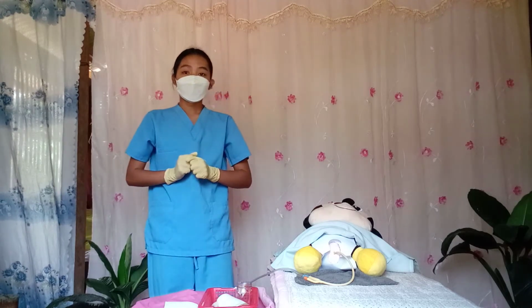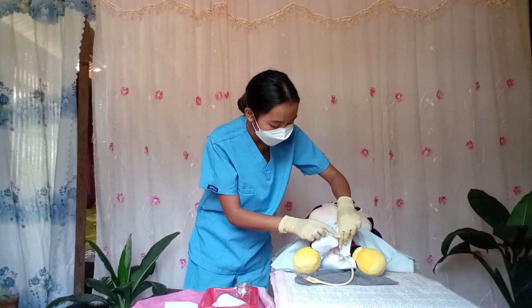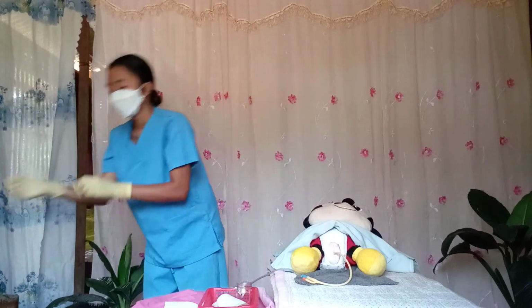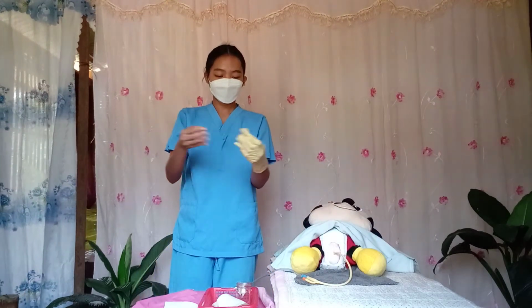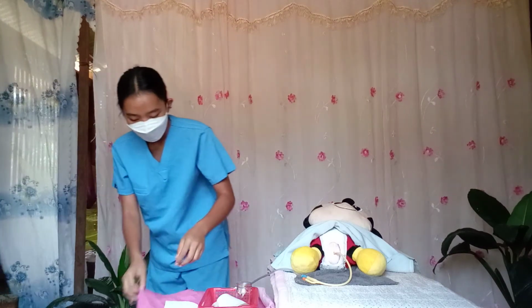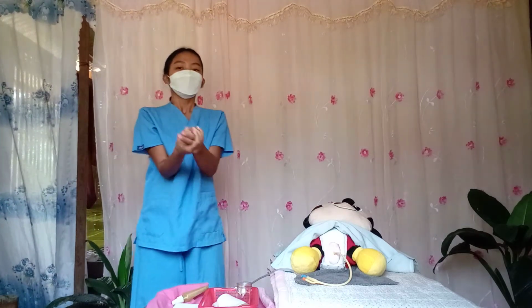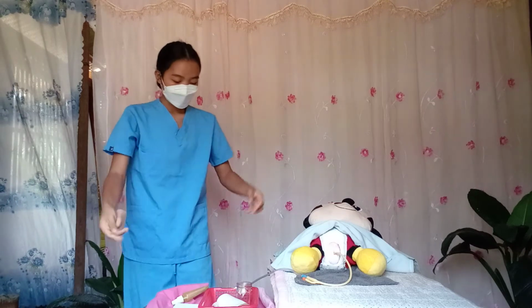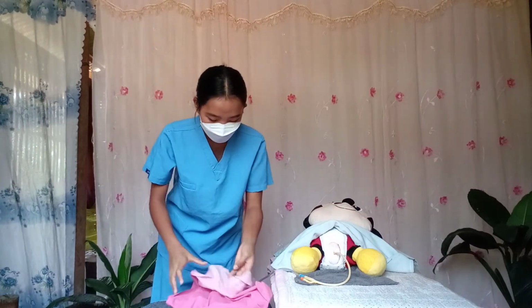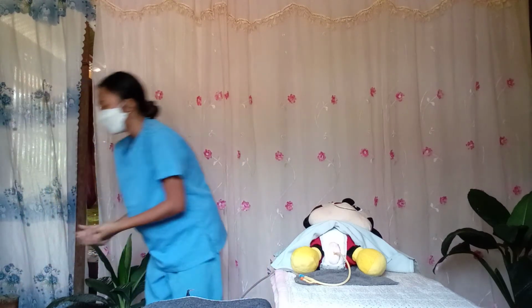So the next thing that I am going to do is remove this eye sheet and dispose of it. And also I'll be removing my gloves, disposing of them, and sanitizing my hands. And I'm going to clean this area. This is to maintain the sterility of the surface, and dispose of it in the disposable bin.